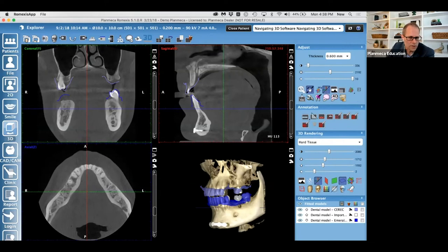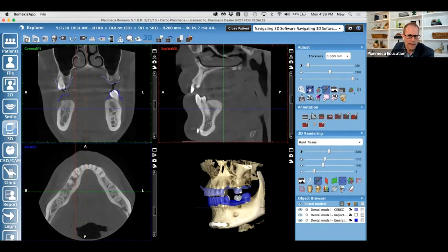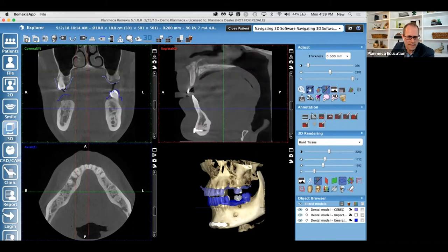Had they positioned the patient in the machine where it's supposed to be targeted, the image would have started here and gone back into the spine. So obviously 10 centimeters deep is more than enough to capture the airway and do some assessment of the airway. And then 10 high, you can see here, gets us plenty high as well. So this is a 10 by 10.